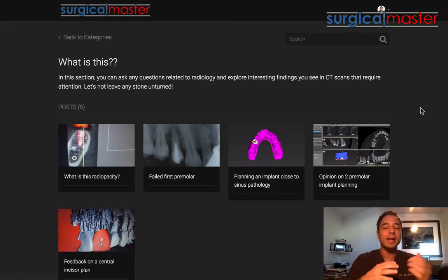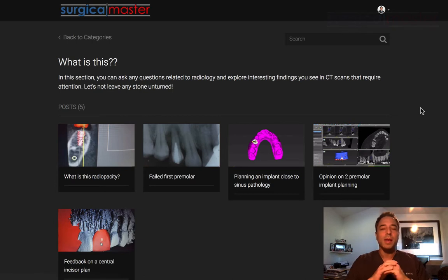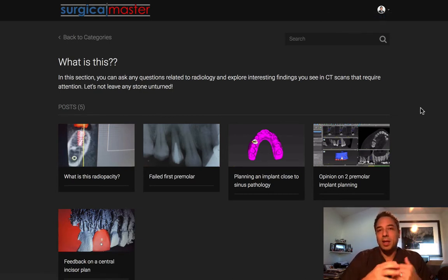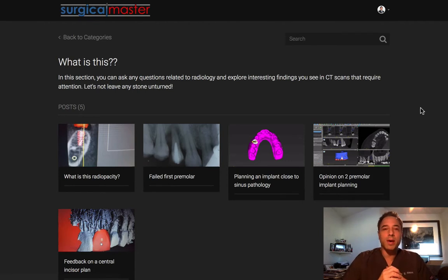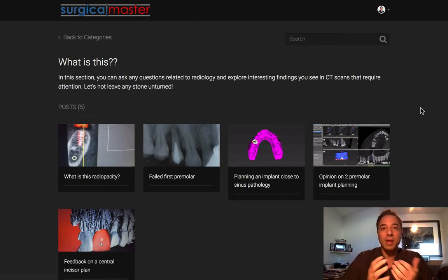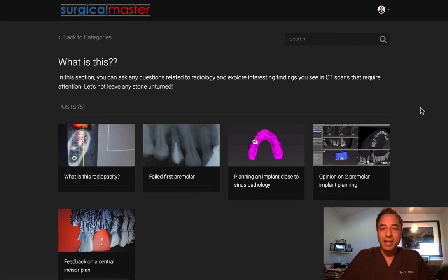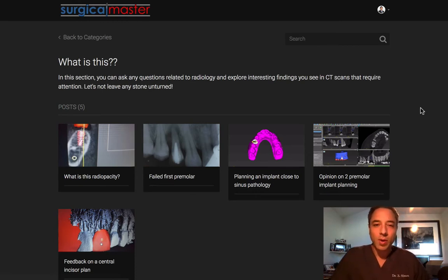And we start interacting. The nice thing about this platform is that it's dedicated for CT scan analysis and learning how to be better at CT scan reading, which is a problem a lot of dentists are having. And this is why I created that.